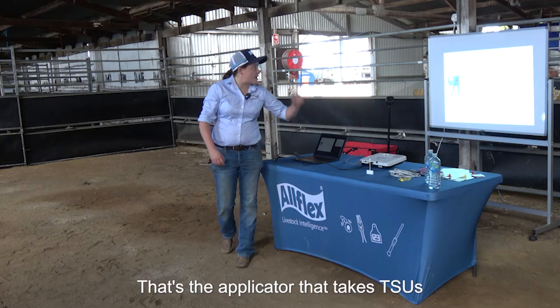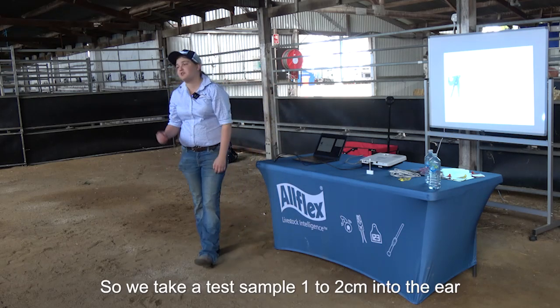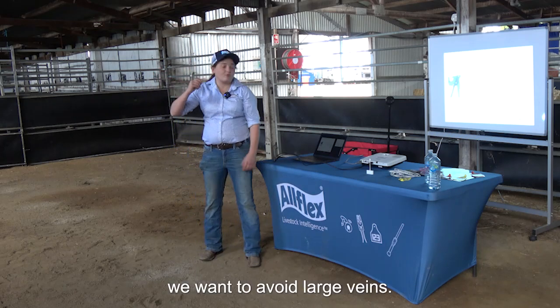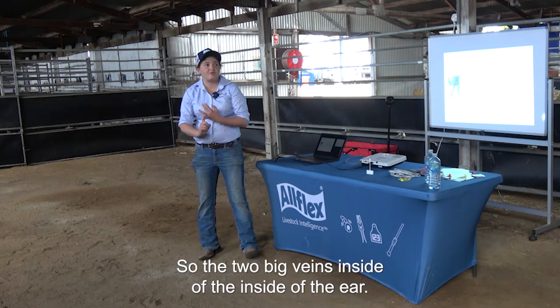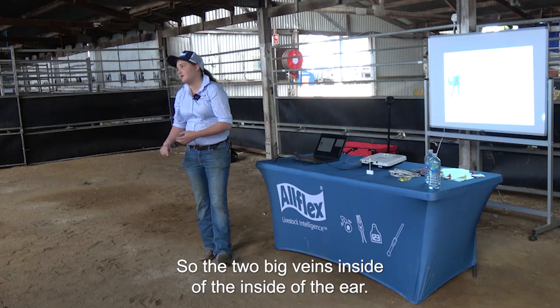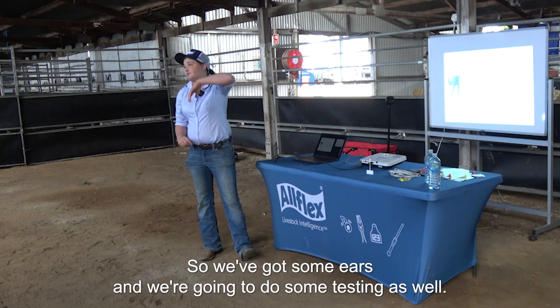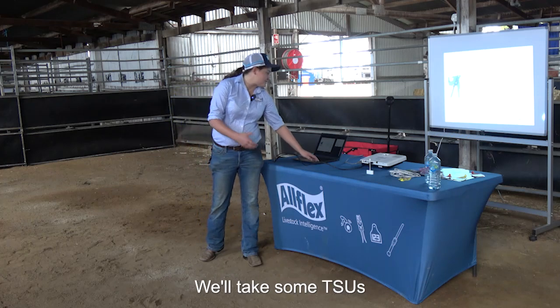Alrighty. That's the applicator that takes TSUs. So we take a TSU sample 1 to 2 centimetres into the ear. We want to avoid large veins, so the 2 big veins inside of the ear, and you want to avoid any cartilage ridges as well. So we've got some ears and we're going to do some testing as well. We'll take some TSUs.